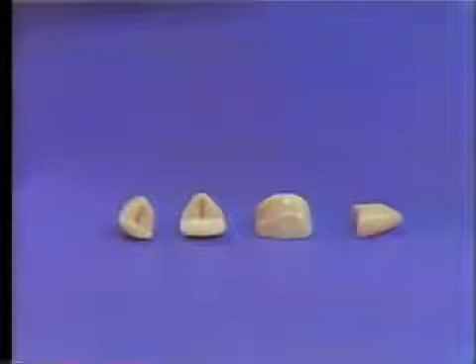They're not used so extensively now as they were, but you will come across many clinical cases with this type of bridge in situ and may need to repair it. Repair is carried out, of course, by selecting a new facing of the correct shade and mold, making any necessary adaptations to it by grinding, and cementing it back in position. When doing repairs, it's often convenient to use the resin facings rather than the porcelain. They're a little easier to grind and less likely to fracture than the porcelain ones.